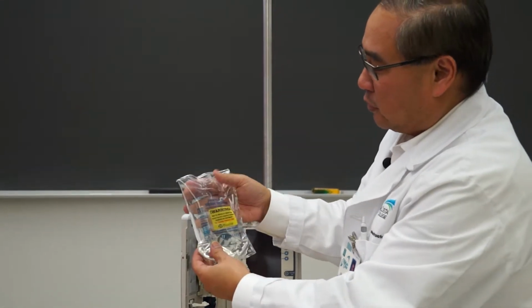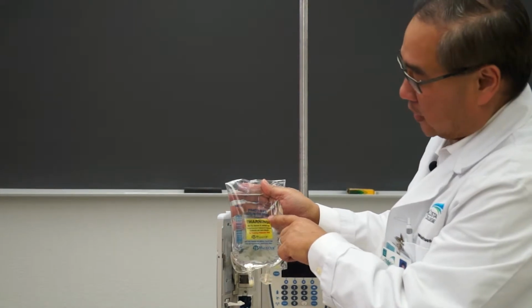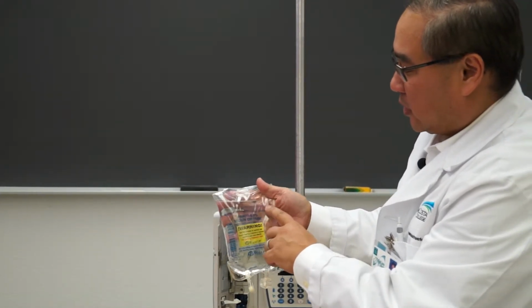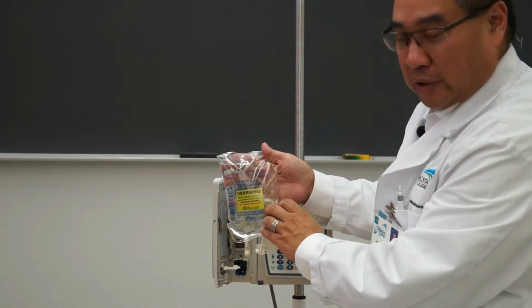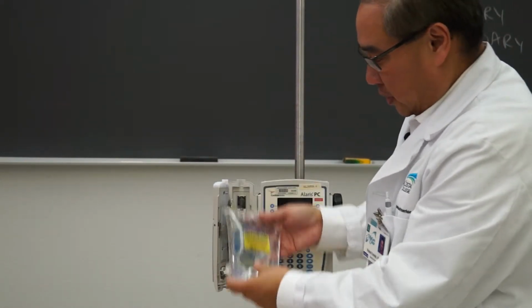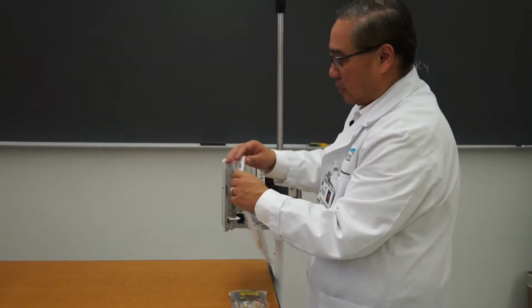Switching to the name, it's normal saline, 0.9%. Remember that is normal saline. And the amount on the bag. Sometimes there will be expiration dates. In this case, this is practice. Expiration date of October 2022. Okay, so that is good. I'll put this down and open up the tubing. Remember that's 20 drops per milliliter.